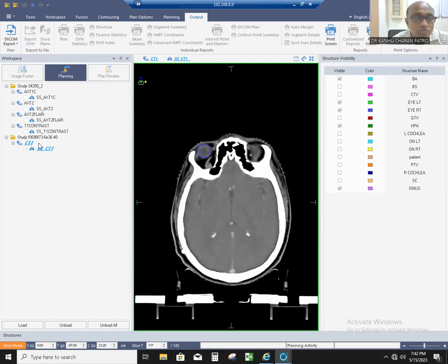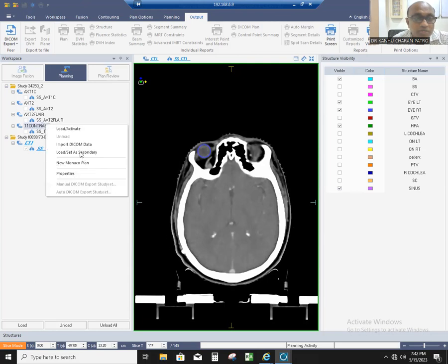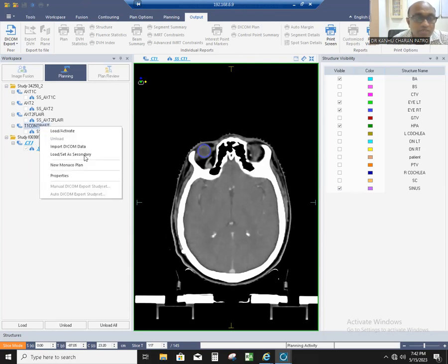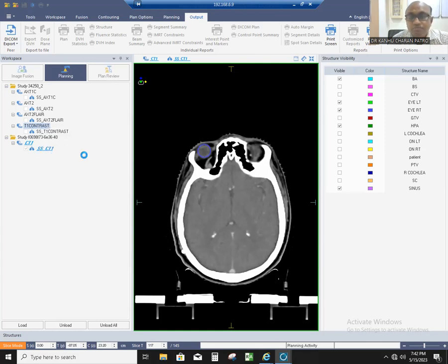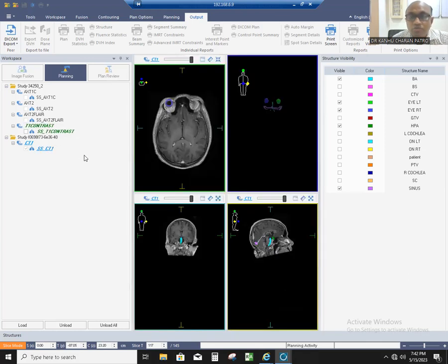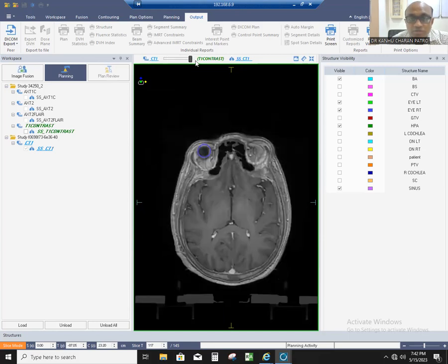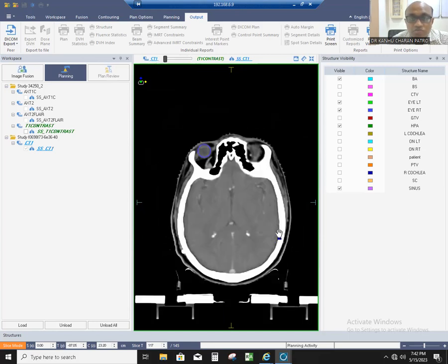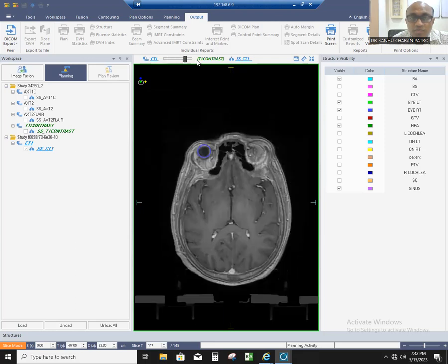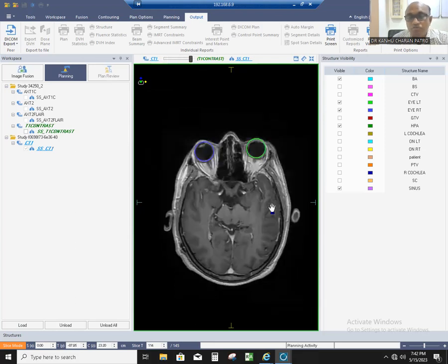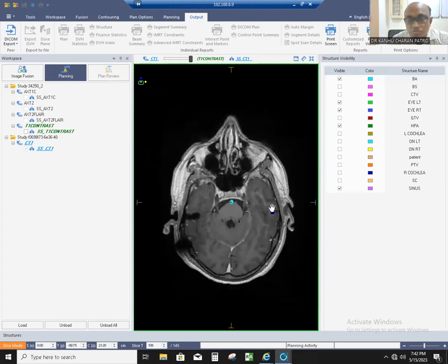Suppose you want to do fusion with contrast. Click on the right, you will get an option to load as secondary. CT scan is your primary, MR is the secondary. These things you have to do properly.